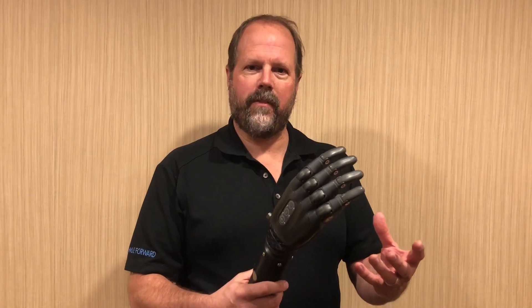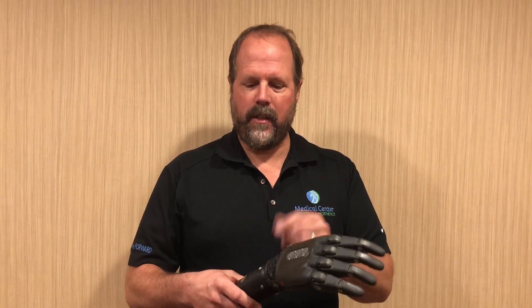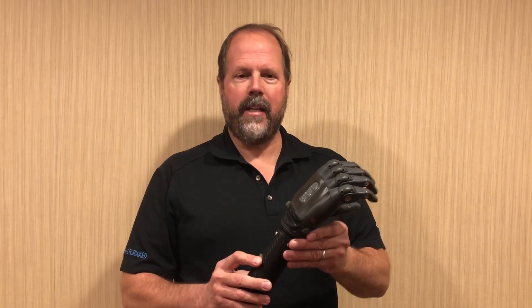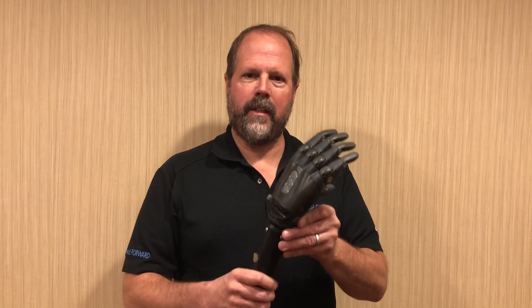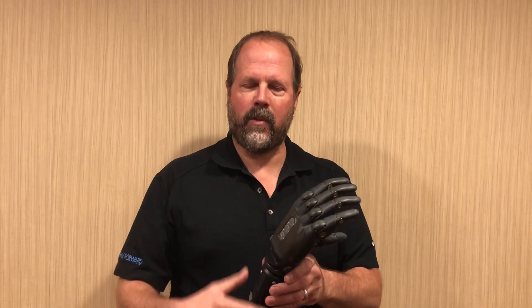One of the great features of this device is that it's waterproof, at least until the wrist, and depending on the wrist we use it can be waterproof higher up on the hand. This hand has a total of 13 different grasps that can be programmed at one time to either use EMG or the buttons on the back of the hand to switch to the different grasps.